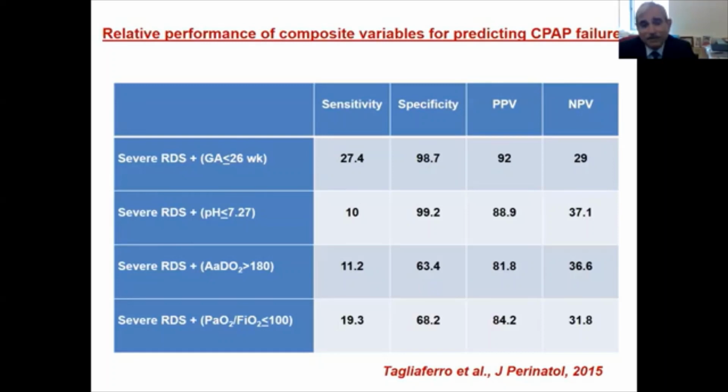And the one person who is converting now was a big proponent of it, speaks worldwide, very well known. And I think I'll be very cautious. Now, if you look at the high flow nasal cannula data coming from the major group in the HIPSTER trial and all those trials, there may be some room if we can define that baby, but in our hands, we are better off getting the baby off respiratory support with CPAP than with high flow nasal cannula. It has its plus points with developmental care, but it prolongs the duration.